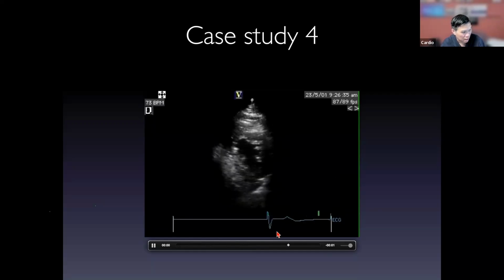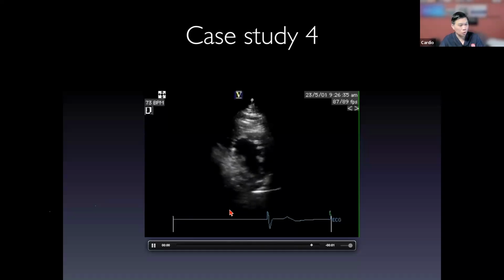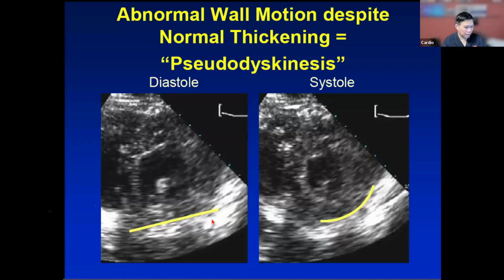But just remember, this is the diaphragm, and there's often a structure immediately underneath it. Depending on where you are, the structure underneath the diaphragm is pushing up. It can be on the inferior or inferoseptal side, or sometimes in the posterior or lateral side. During diastole it flattens, during systole it rounds up.